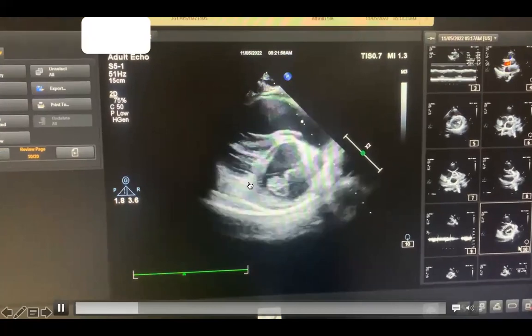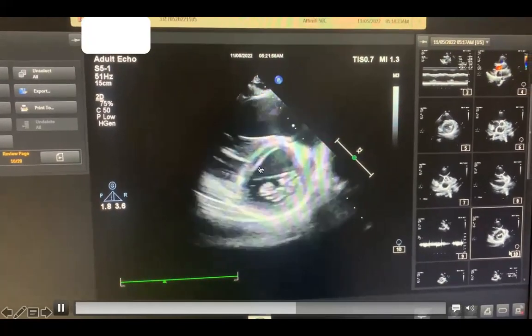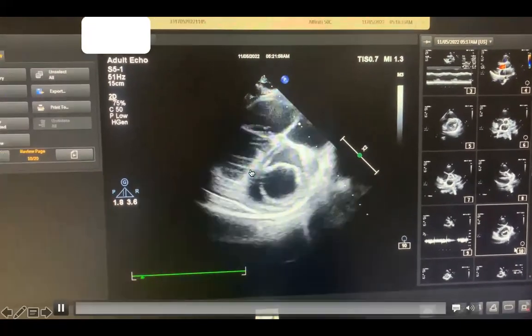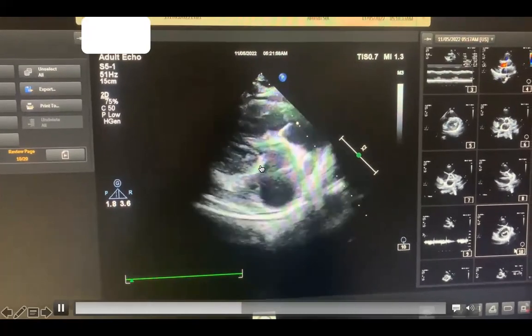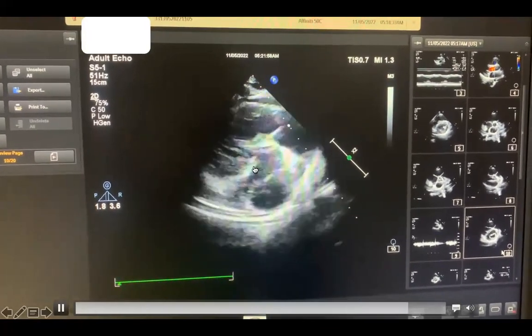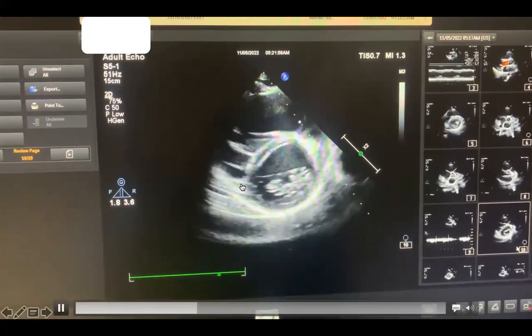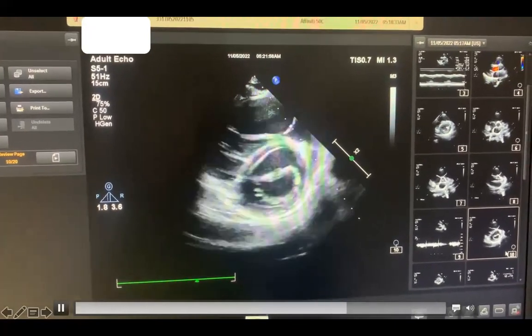I know the image is not ideal, but you can see some sort of flattening of the septum. It is not the typical flattening, but there is some degree of flattening of the interventricular septum.